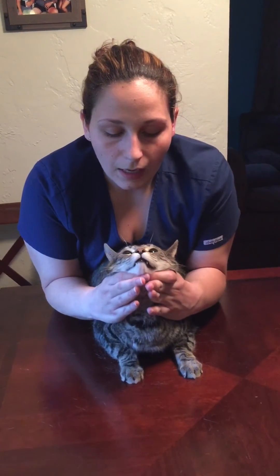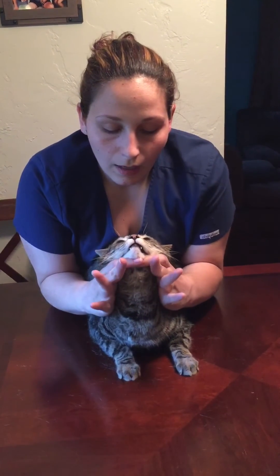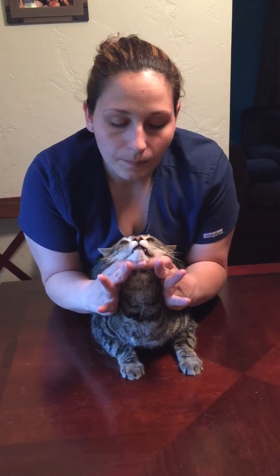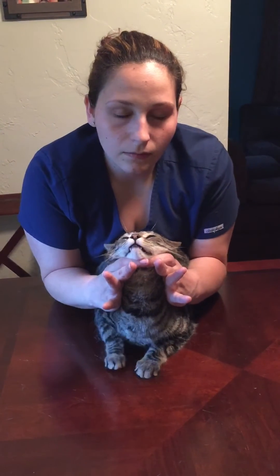I'm always cautious to make sure I put some of my weight on the cat so that he can't back up or use his front paws to swat the person. It's also important to make sure your fingers are never near his mouth because he will bite — this is not a normal position that they want to be in. Basically, put some of your weight on the back of the cat, tilt their head up, and spread your fingers out so the person has access to the neck and can feel for the vein.